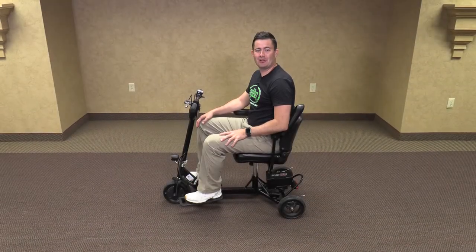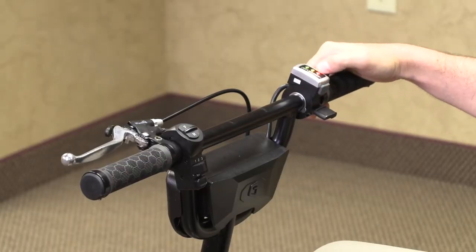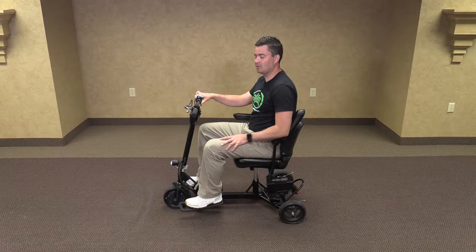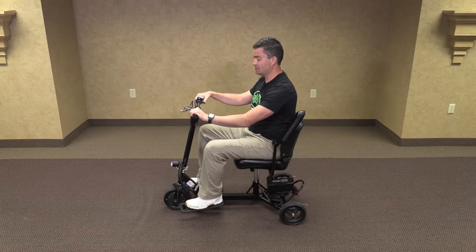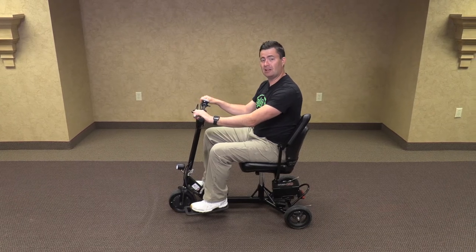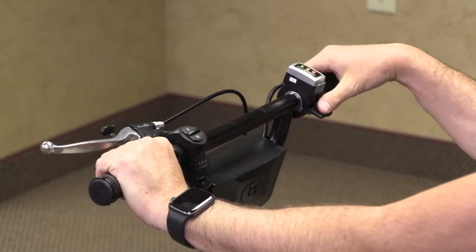Now I'm going to show you the operation of your Glyon Snap and Go Model 335. We are going to turn it on, showing full battery, and now we are going to depress our thumb control accelerator. If you depress your thumb accelerator and it does not move, make sure that your parking brake is disengaged. The parking brake has two functions: one, it locks your wheels; two, it turns off the motor. If it is not disengaged, you cannot move.